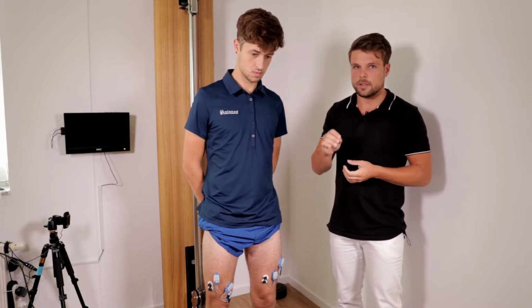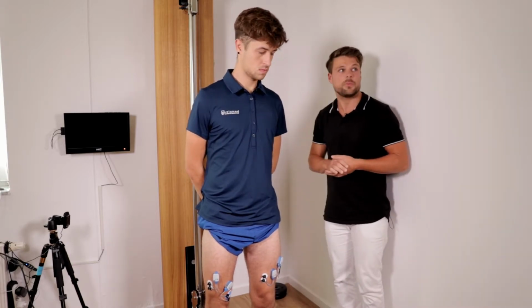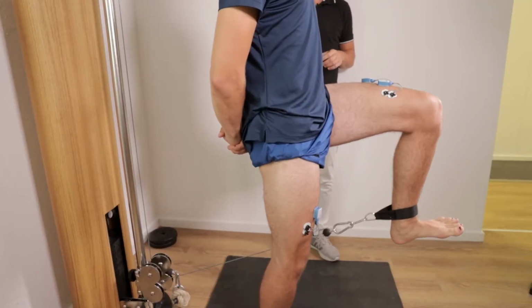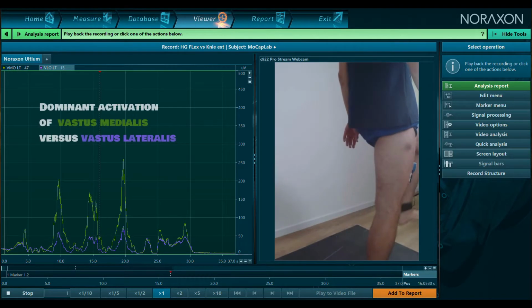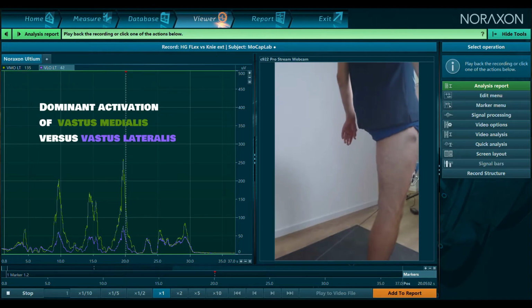should train the vastus medialis in hyperextension with the external rotation of your hip. But otherwise, you can show your patient that there are different ways to train your vastus medialis. For example, hip flexion. Do it. And now you will see an increase of the activity of the vastus medialis dominant against the vastus lateralis.